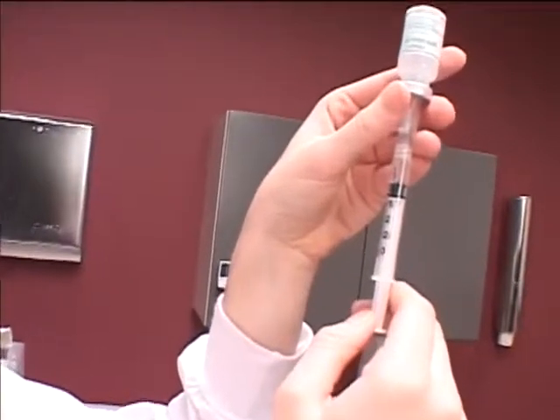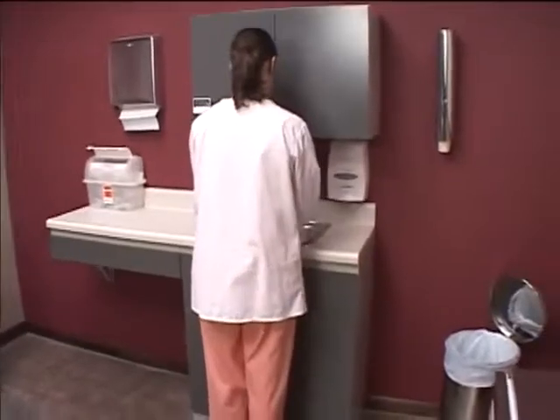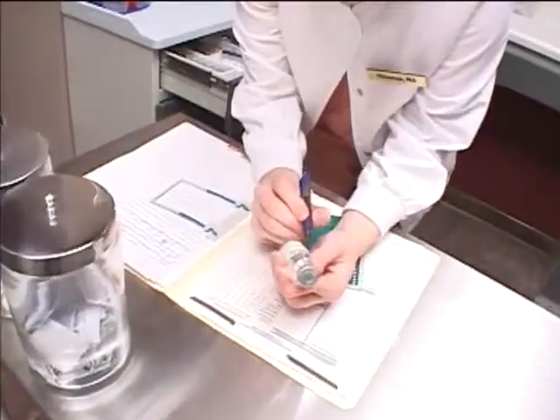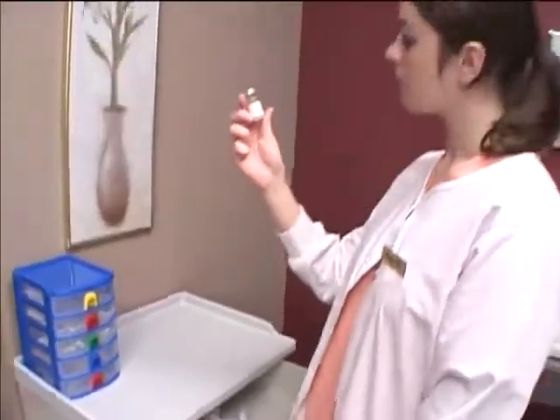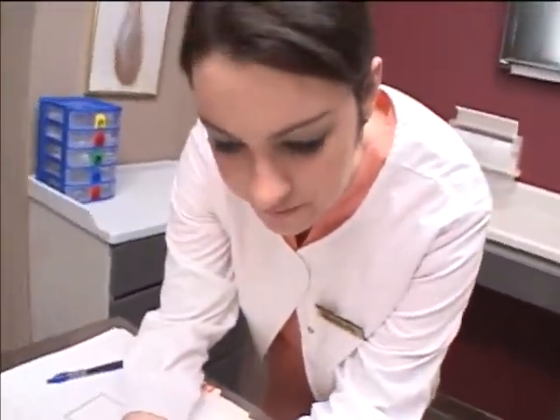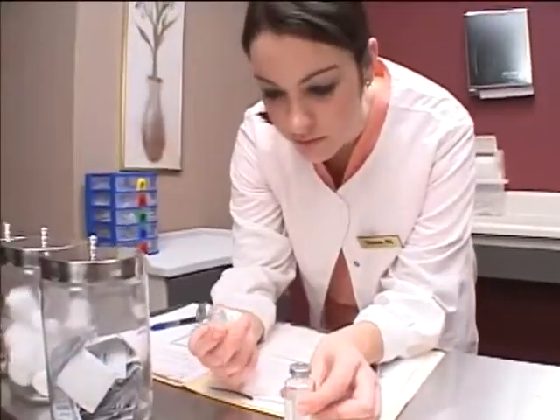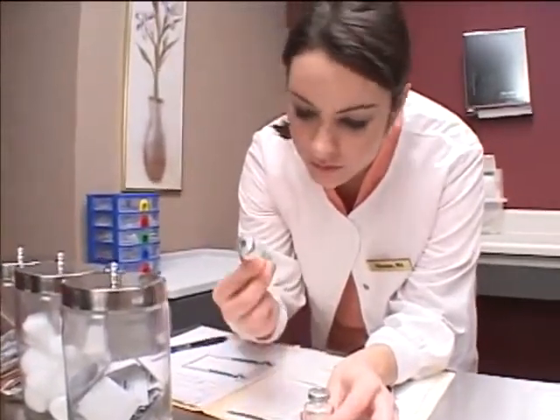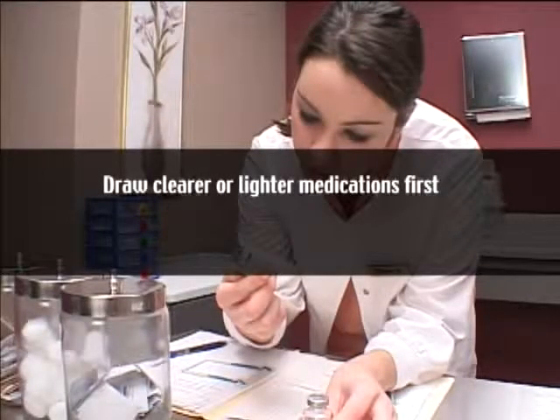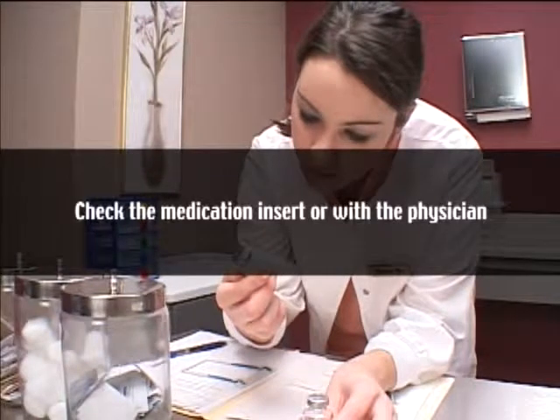When drawing up medication from 2 vials for administration, you should begin by washing your hands. Then, select the appropriate vials and prevent error by verifying them against the physician's order for the 6 rights. Determine the route the medication will be delivered to ascertain what size syringe and needle will be needed. Determine the order that the medications will be drawn into the syringe. The usual standard is to draw up clearer or lighter medications first, and then darker or cloudy medications second. But check the medication insert or with the physician for further clarification.